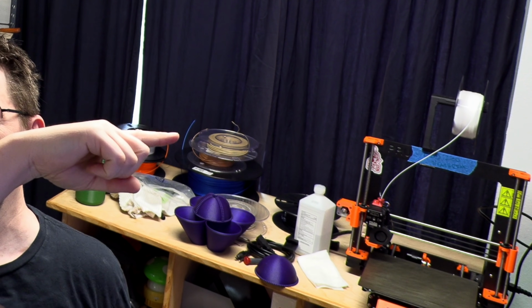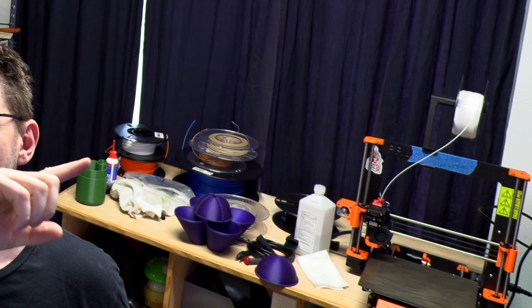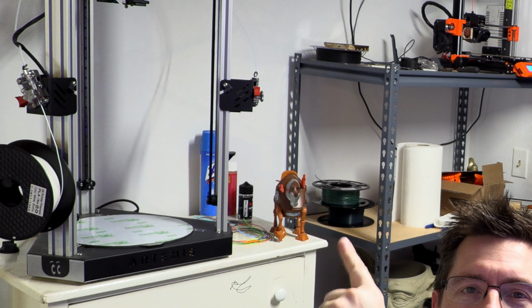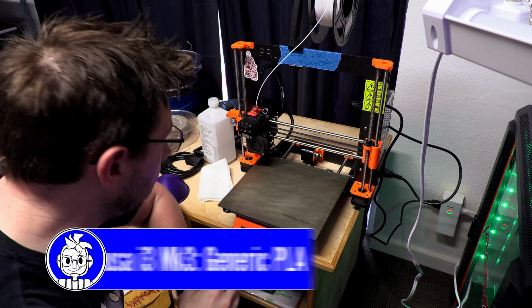So over here, I've got a Prusa Mark III, and it's running some generic PLA I found. Up here, we've got a Prusa Mark III running the Prusa PPE Orange PETG. And then right here, I've got the SeeMeCNC Artemis with a Dexto 0.6 millimeter nozzle running Creality PLA. We'll start with that one. Come closer. We'll start with the Prusa Mark III.